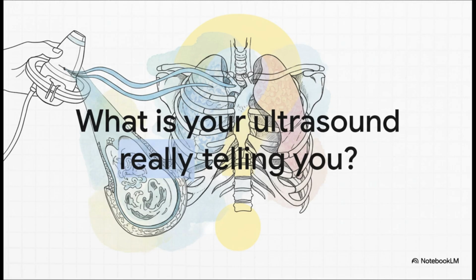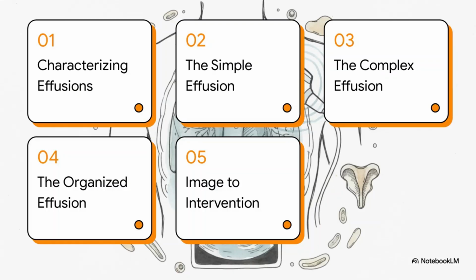So, the real question we're digging into here is this. Once you've answered, yes, there's fluid, what else is the ultrasound telling you? We're going to move beyond simple detection and get into detailed characterization. And that's the key to making smarter, faster clinical decisions right there at the bedside.